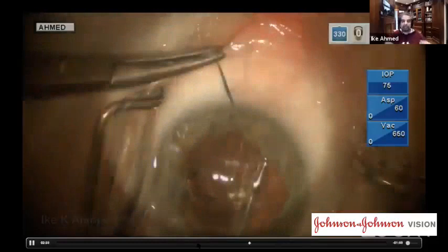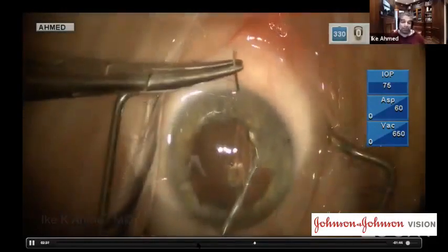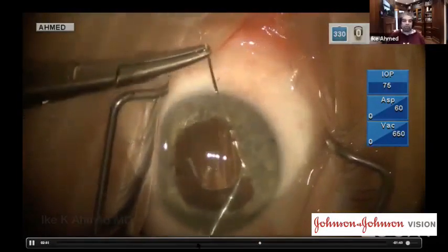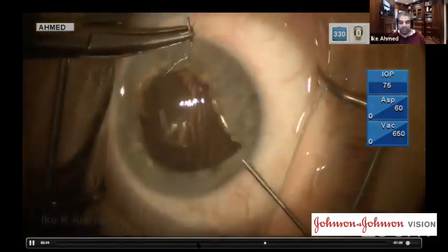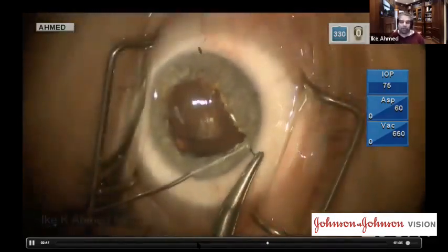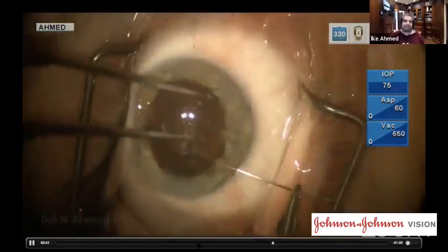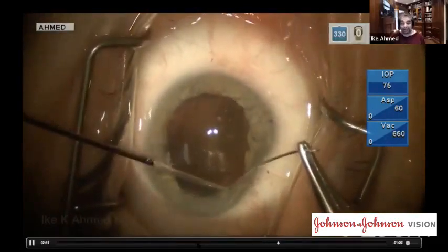It's very helpful to be a bimanual surgeon. Here we're using our left hand to grab the needle, and the right hand using the micrograsper. This is a basting suture technique where basically we're rolling the needle around the iris tissue. This creates a more round pupil. For me, it's very important to get the pupil as cosmetically pleasing as possible. I realize sometimes it's difficult when we have missing iris.